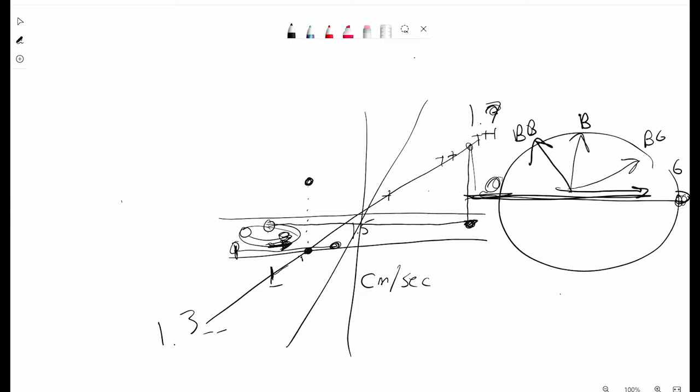And the whole point of it is to be able to see, if I have really, really slow flow, if it's only going to go from here to here, the only way to really separate this really slow flow is if I jack this Venc up big time. So now even something going from here to here has experienced a gigantic change in the magnetic field strength. So they have a large phase shift. See what I'm saying? And that's when you're going to get that stimulation more.